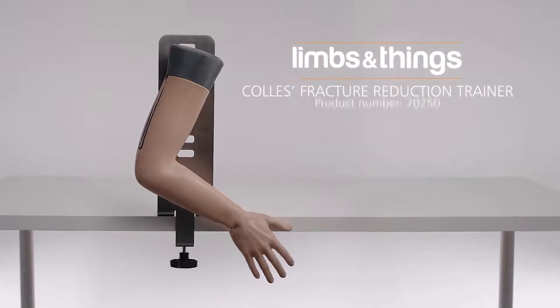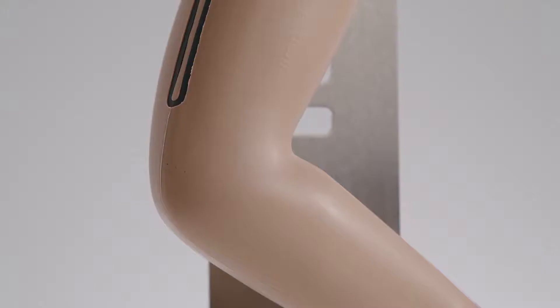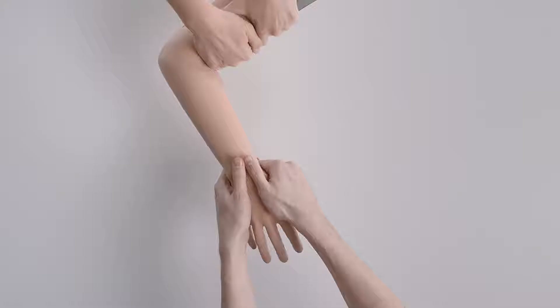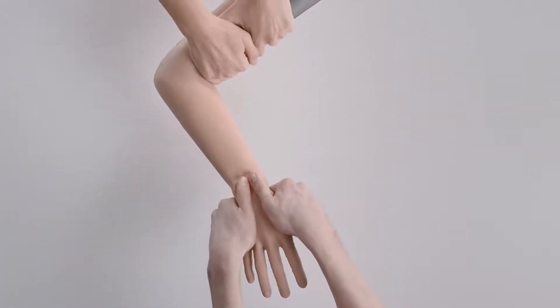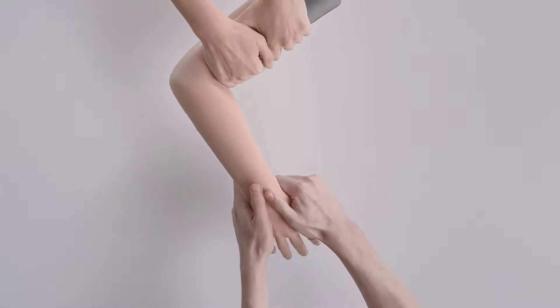This is the Limbs and Things Colley's Fracture Reduction Trainer, an anatomically accurate arm which supports trainees to gain confidence associated with successful management of Colley's fracture.